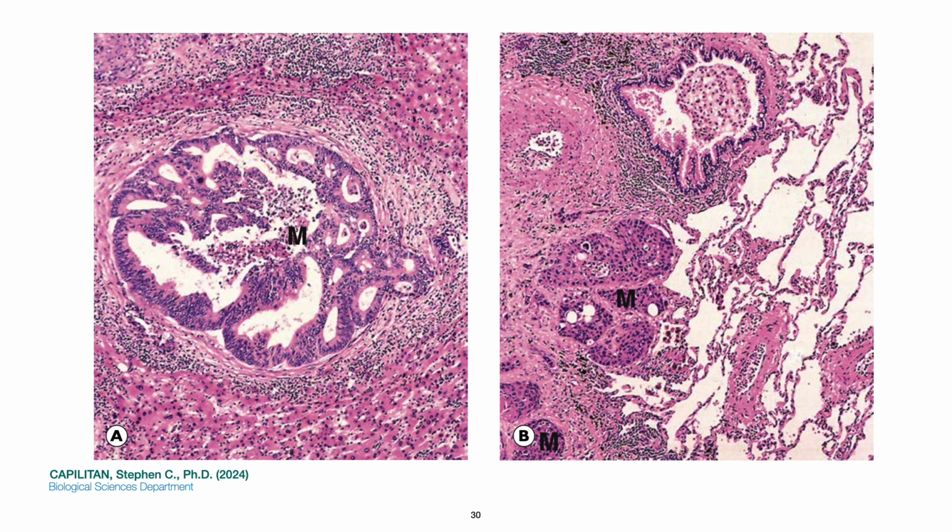This is a metastatic tumor deposit in solid organs, in the liver in medium power in letter A, and letter B is the lung in low power. As noted above, metastatic deposits of tumor are frequently encountered in liver, lung, bone marrow, and brain as a result of hematogenous spread. Other tissues are less common sites for deposition of metastatic tumor, for example the heart and skeletal muscle.